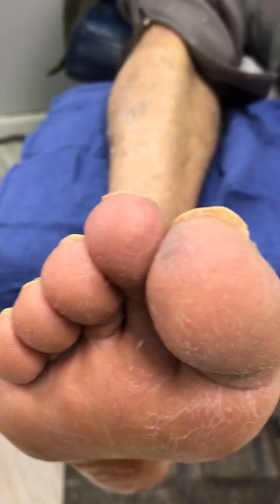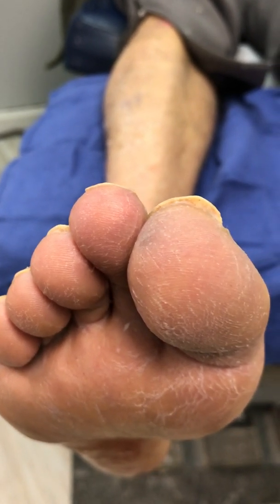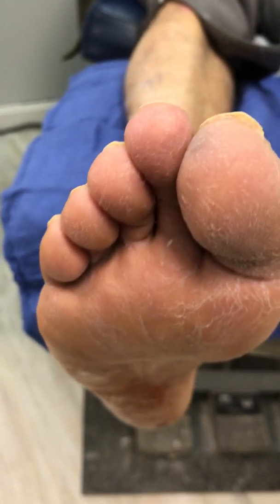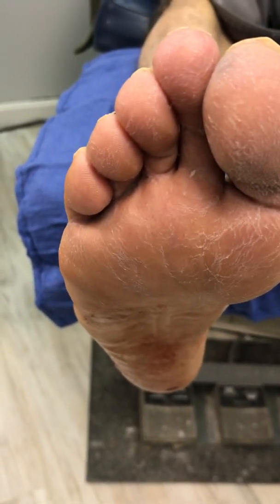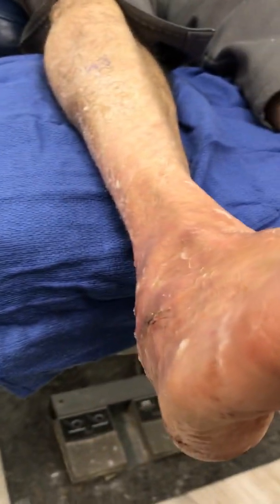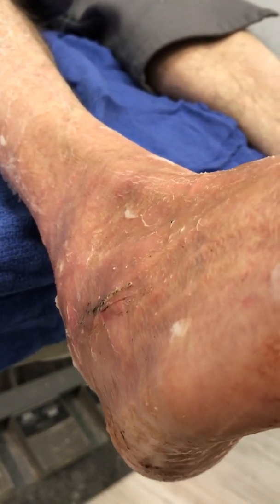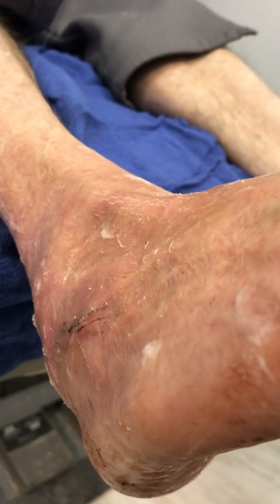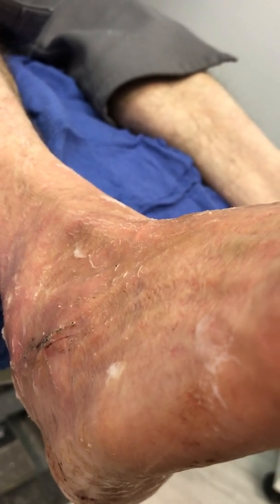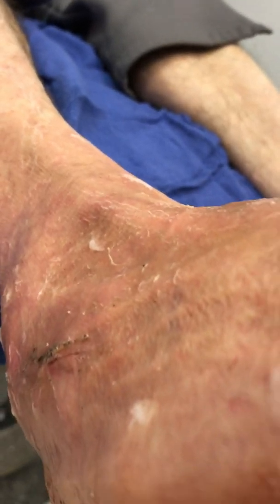As we look closely, his second toe is right in line with his shin bone, so this individual underwent an Achilles lengthening to address the sagittal plane. As we look at the second toe in regards to the heel and the arch elevation, we addressed the transverse plane by putting a wedge — an iliac crest wedge — that measured 1.0 centimeter, which he required to align the forefoot-to-hindfoot relationship. So those address the transverse and the frontal lateral plane.